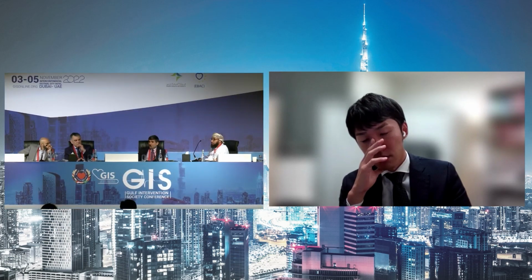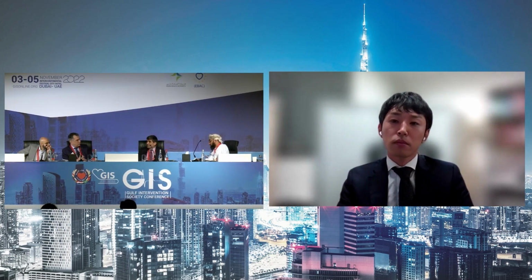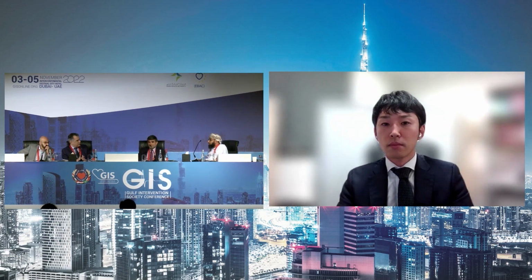But again, this shows the importance of intravascular imaging to plan your procedure and execute it and make sure that you delivered it very, very well. Okay. I totally agree. Whatever modality of intravascular imaging that you're comfortable with, you should go ahead and use it. OCT or IVUS, OCT gives you a more delineated lumen in a nice way and shows you more details. But if you are very comfortable with your IVUS as well, it's a tool that you can use. We tend to go into more details.